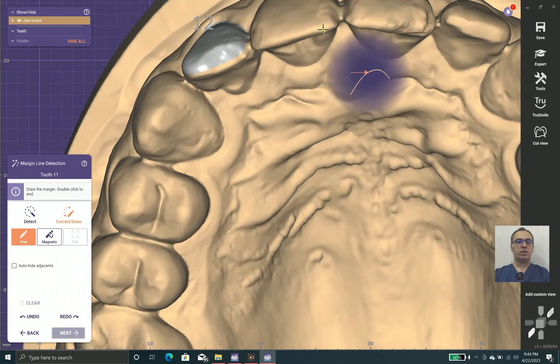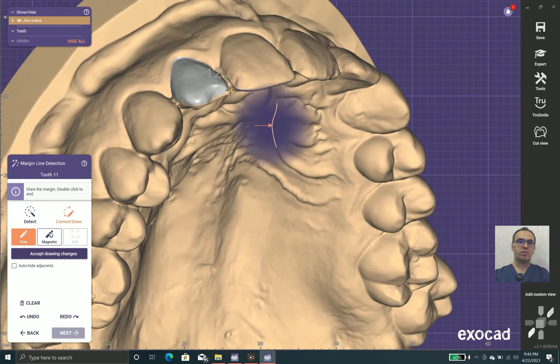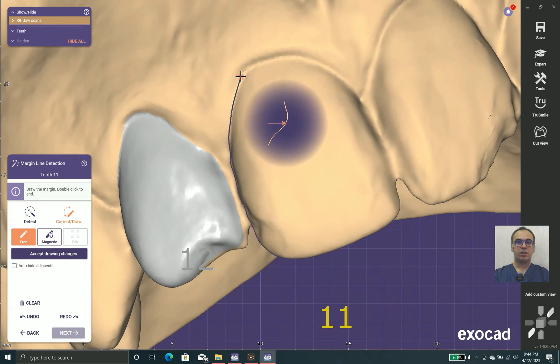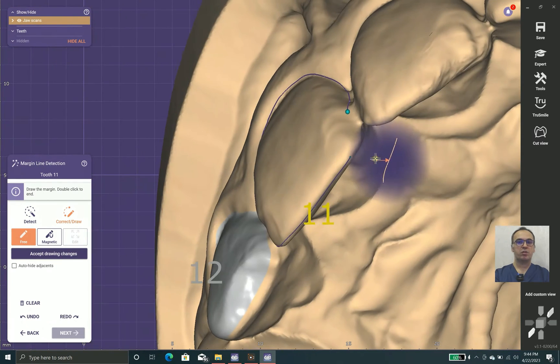First, we put the laminates with space between them and place the margins far from each other. We observe what happens and then move the margins to a proper position.